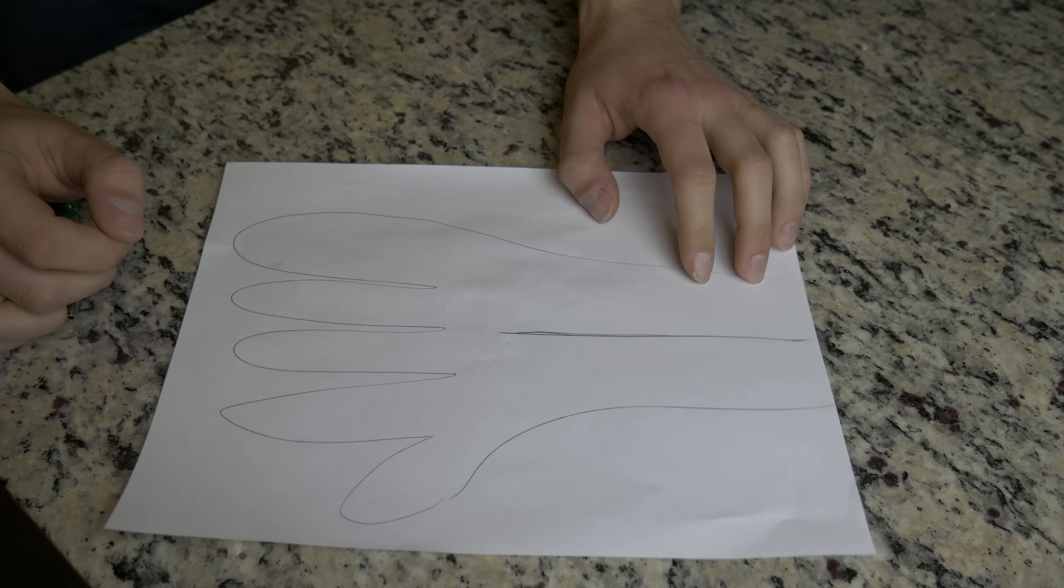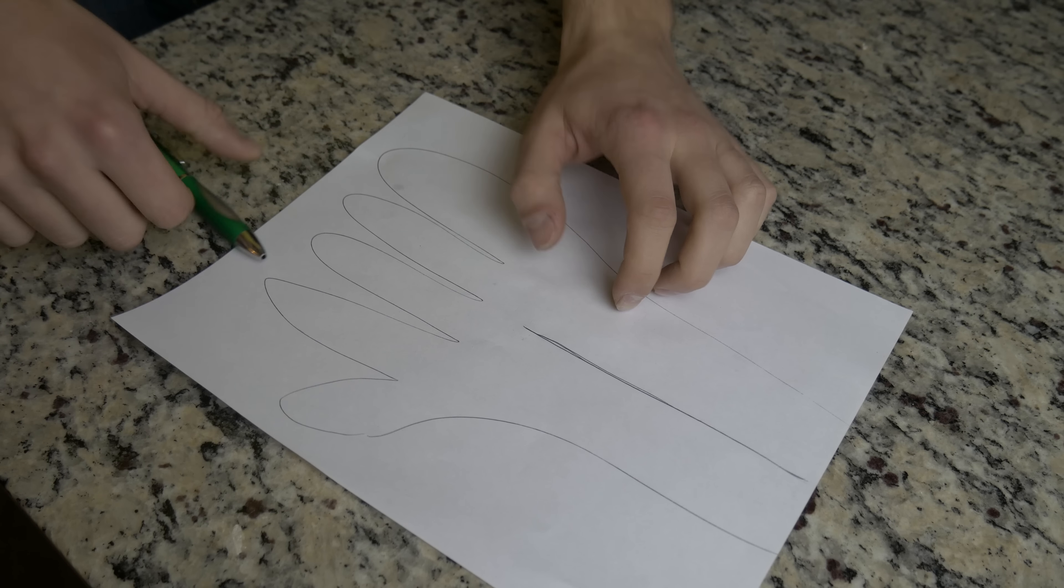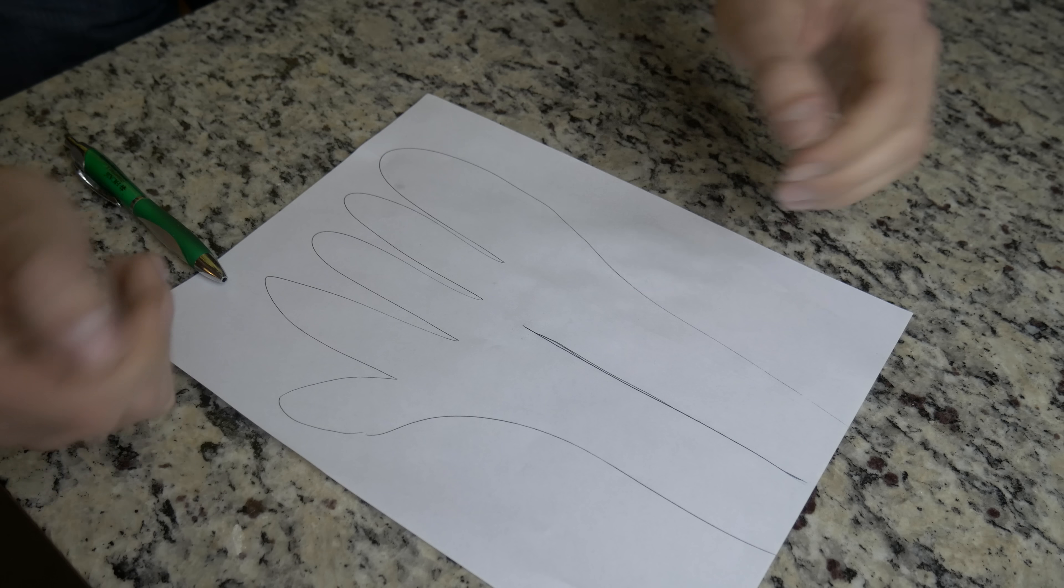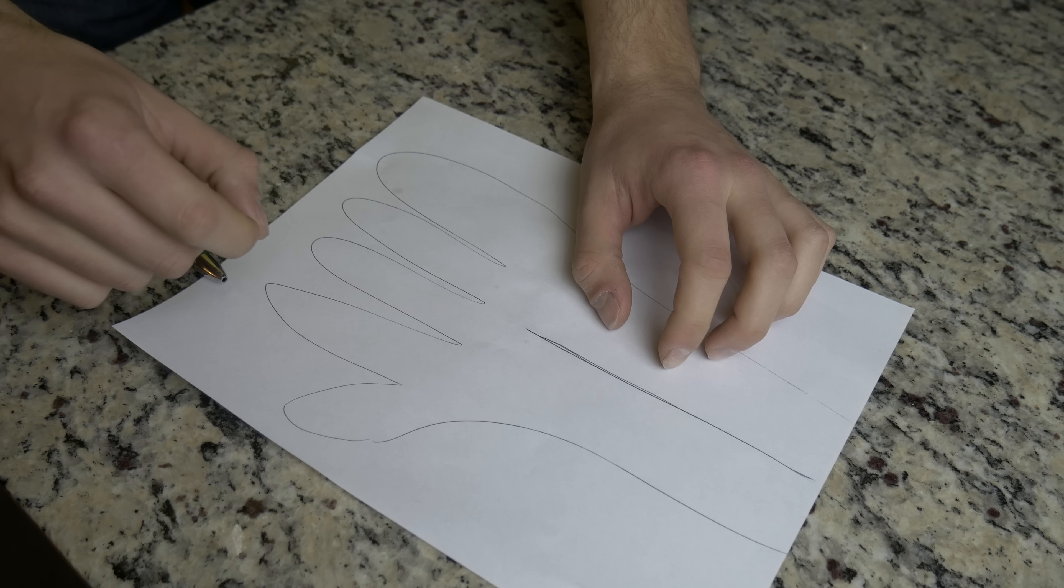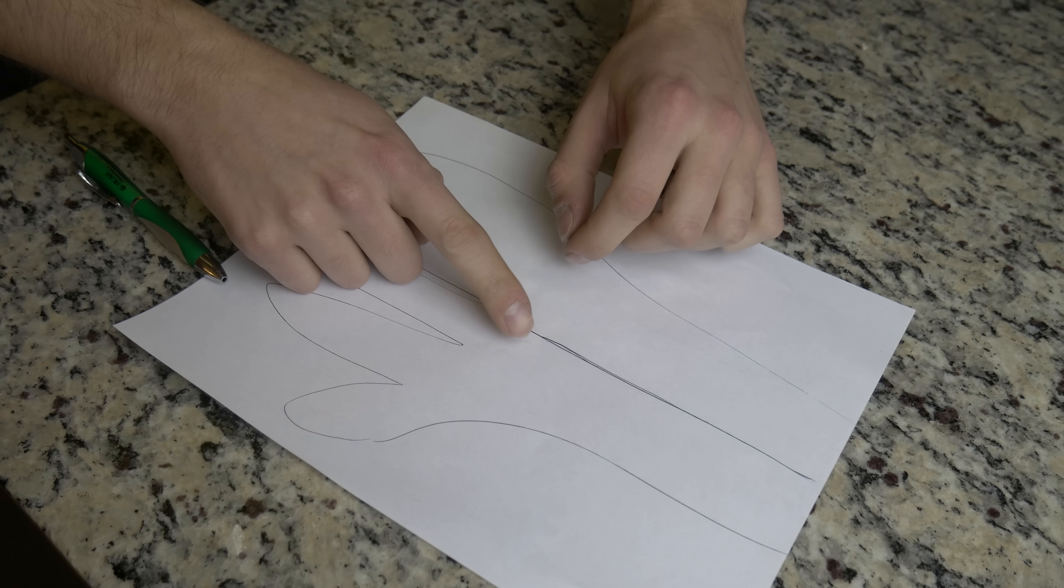So here's my hand, here's my arm. This line in the middle here, that's going to be the vein. Let's say you put your tourniquet on up here if you need one at all.